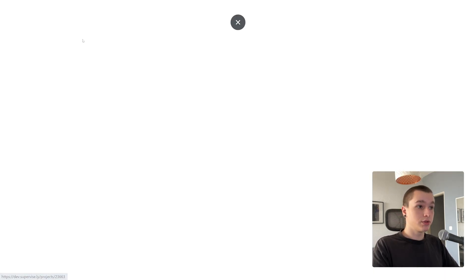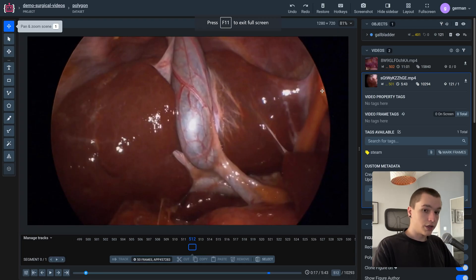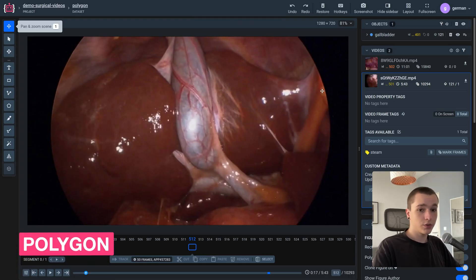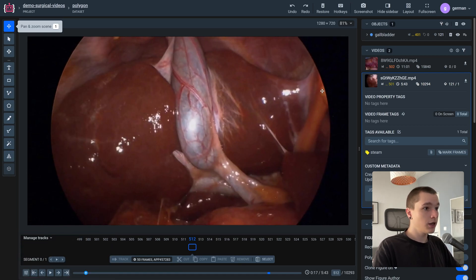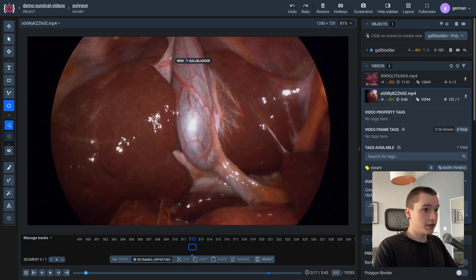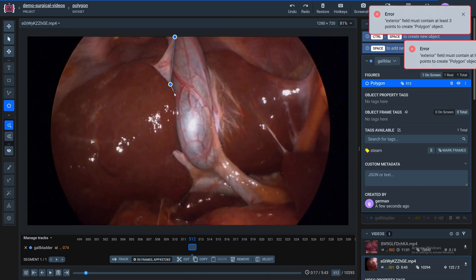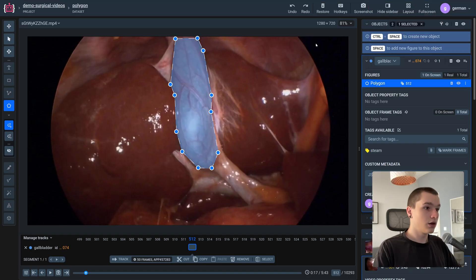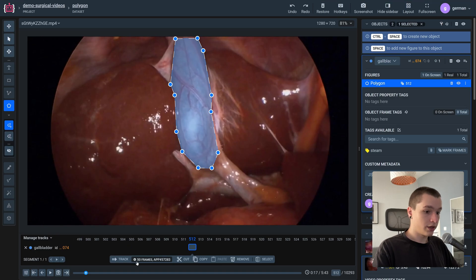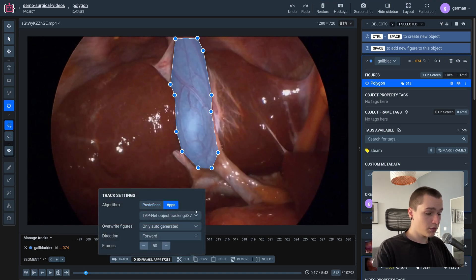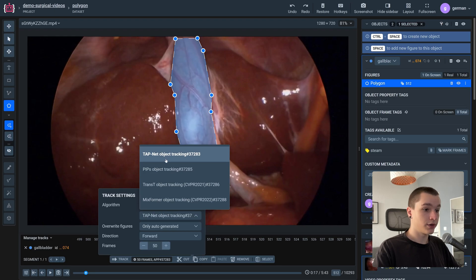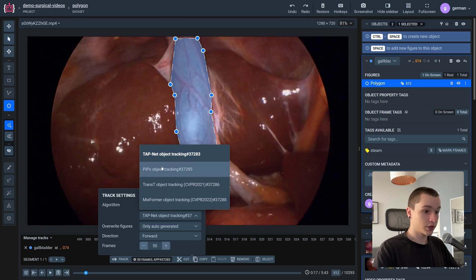Let's move on to the next step of annotation. The next annotation type is polygon. It is quite similar to the rectangle procedure. Let's grab the polygon tool and segment this object. I have segmented this object. Again, we have to go to the Track Settings tab and select the object tracking neural network of your choice.